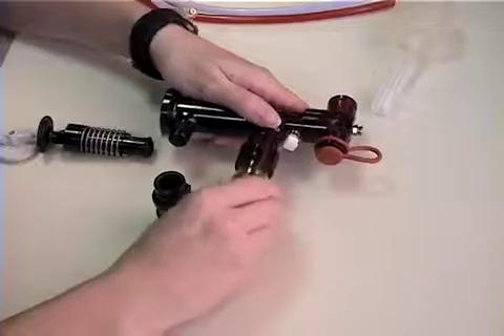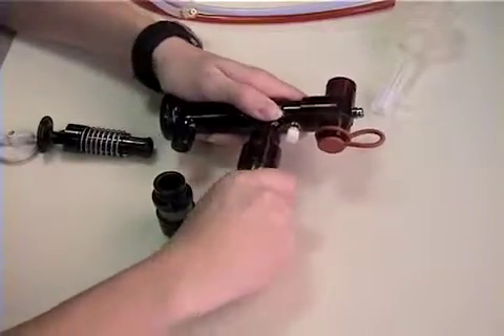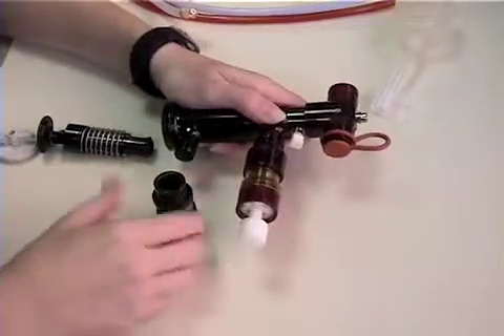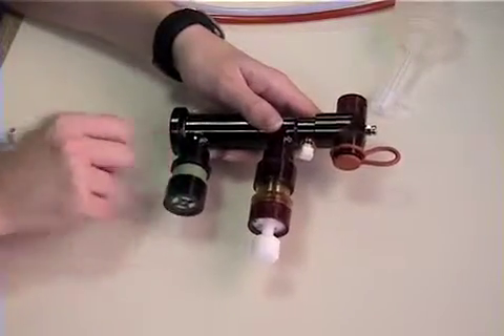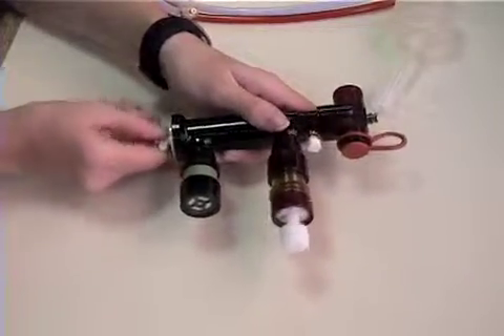The mean airway pressure and PEEP valve is placed in its port. The venturi one-way valve is placed on its port, and then the spring assembly is placed in the main housing, followed by a cap that screws on.